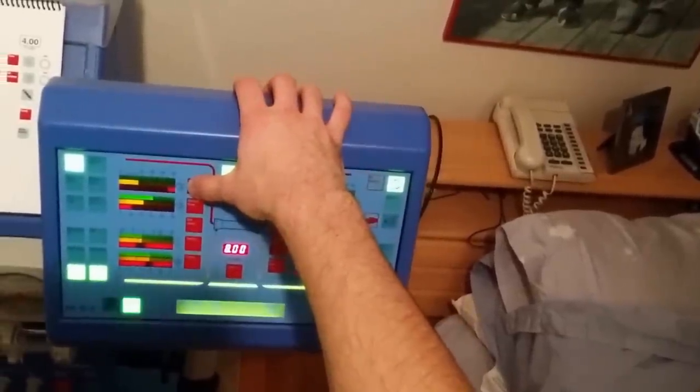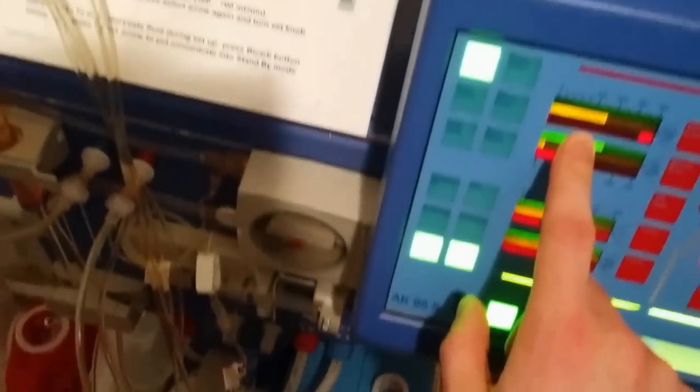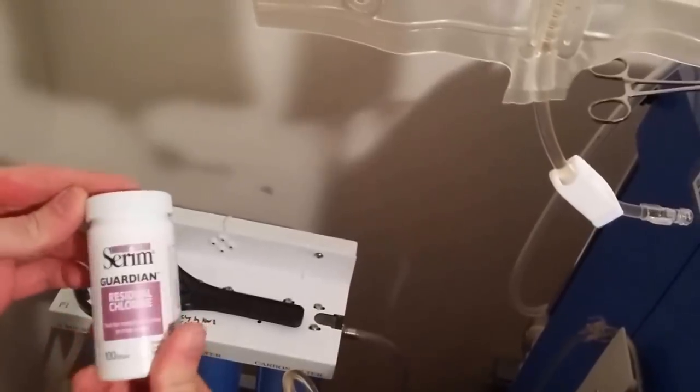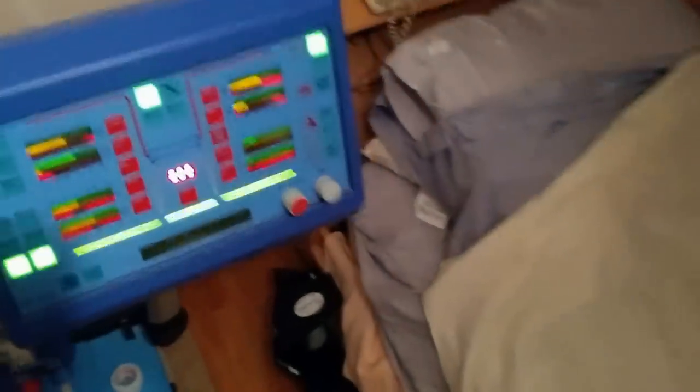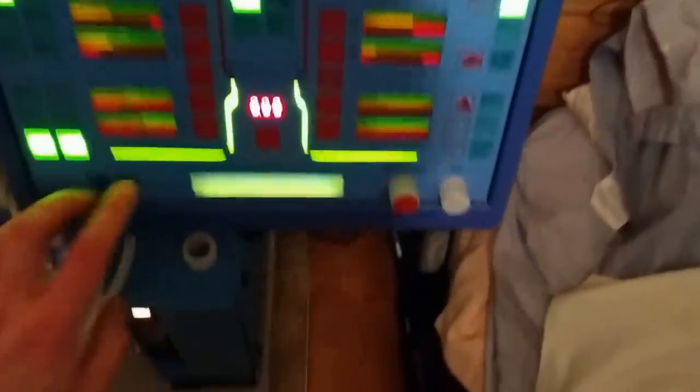We've completed that setup. The machine is doing something called the venous pressure test — it makes sure that all the sensors in the machine are working. Basically this whole setup also involves a lot of automatic procedures that the machine does to make sure it's working safely. So if something were to happen, the machine would tell you. The machine does a lot of checks behind the scenes, and this pressure test successfully passed.